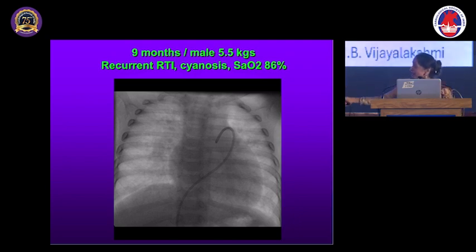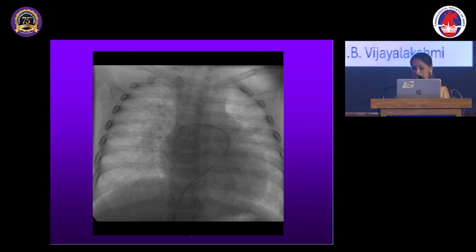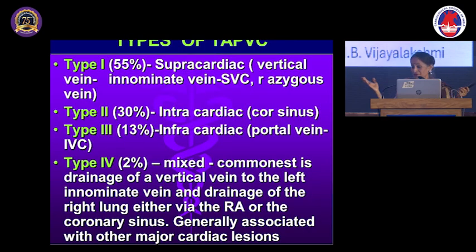So this is the LV, but there is a non-compaction. And non-compaction with what you see? A VSD. Dextrocardia, non-compaction with the VSD, and it is so easy, you can just go through and cross the VSD with the floppy guide wire, and over that you push the catheter and close with the device. Within 5 minutes you are done with the closure.